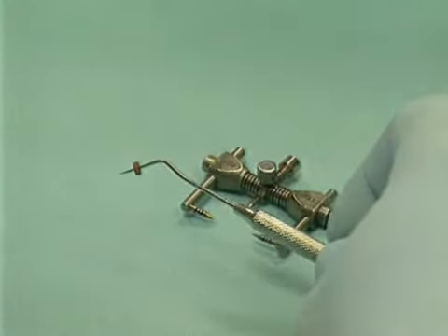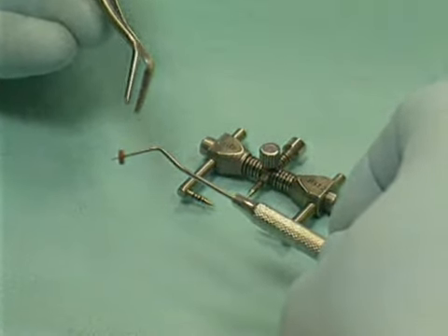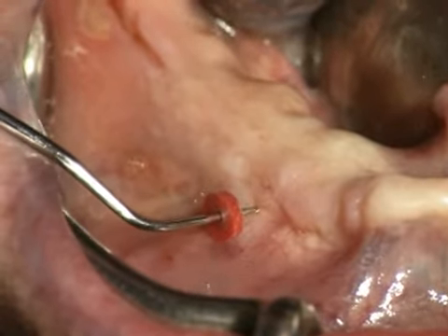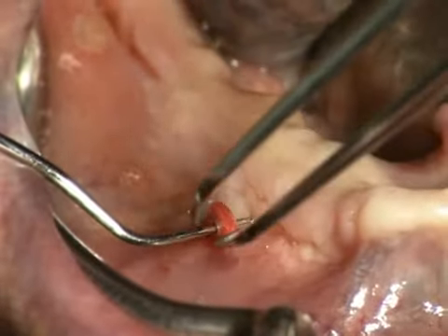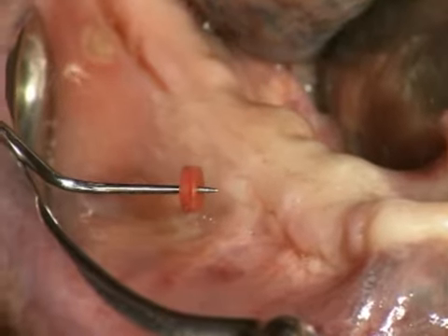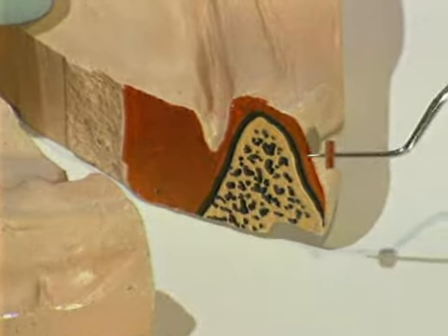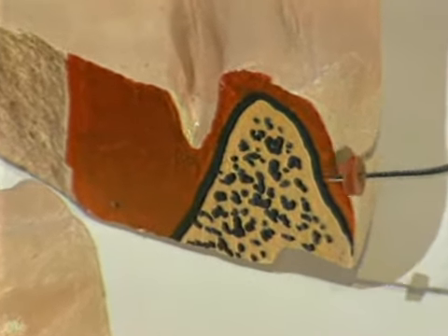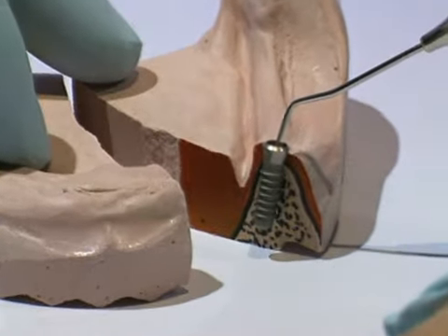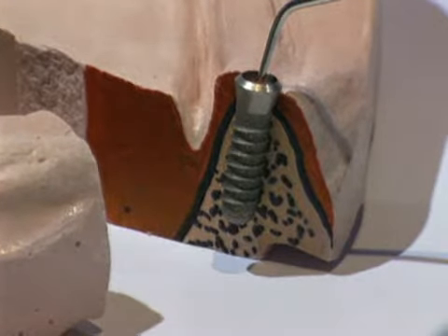The thickness of the mucosa is best measured in mucosal anesthesia using a dental probe with a movable silicone stop guide pushed over its tip. In this way, the alveolar process is sampled at several sites. The values obtained are transferred to a saw-cut model for bone mapping, which results in a rather faithful cross-section of jaw width. These data provide a good basis for anticipating the diameter and axis of the implant.